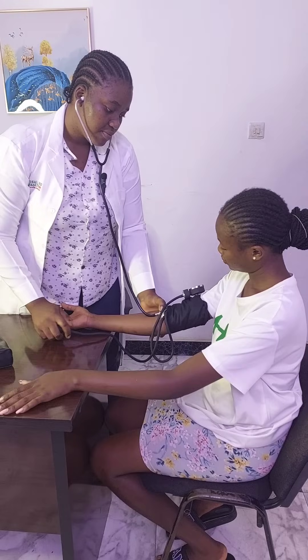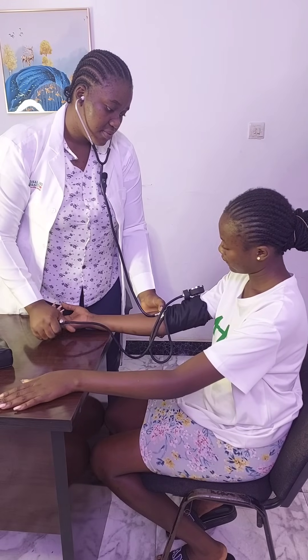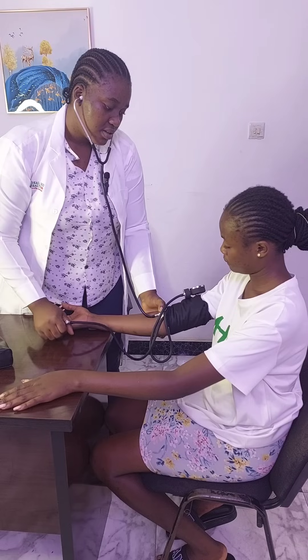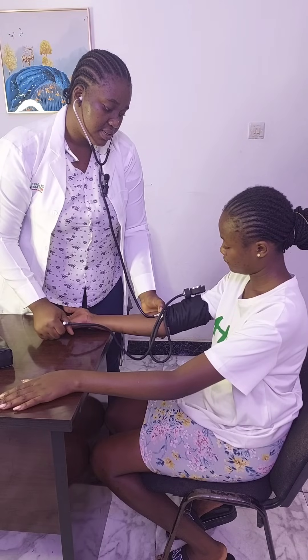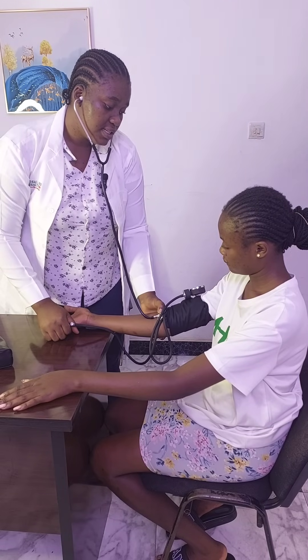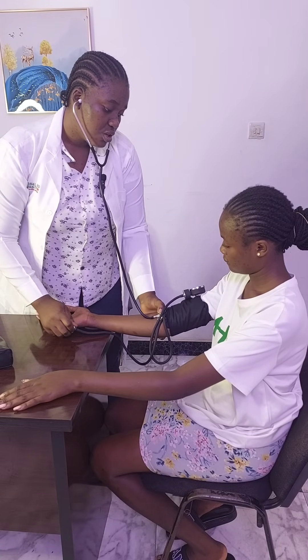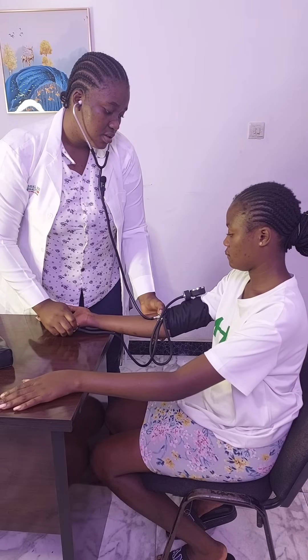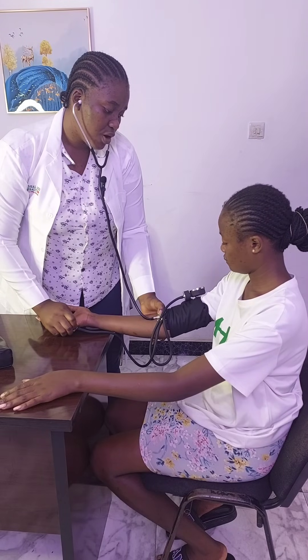You pump the cuff slowly until the pulse disappears — this is an indication to stop inflating. Then you deflate the cuff slowly until the pulse appears.